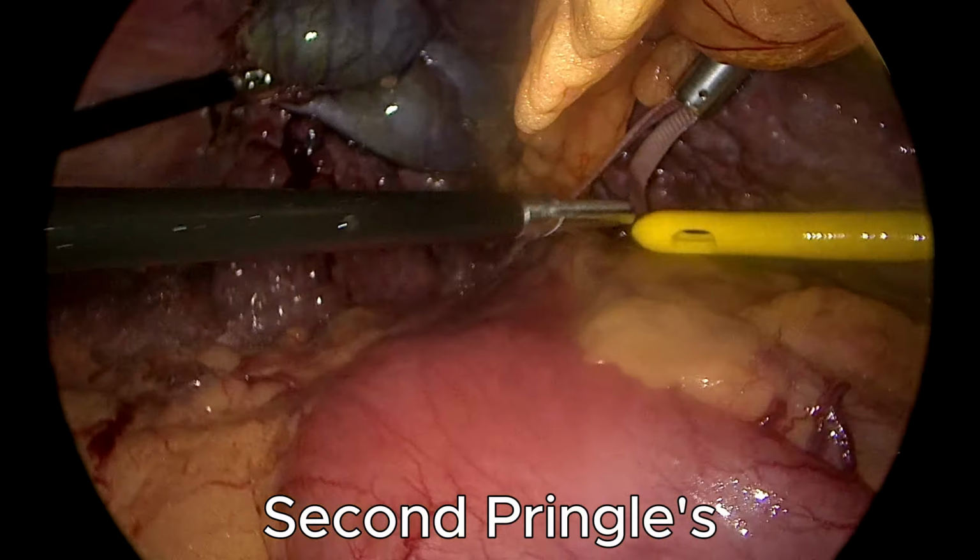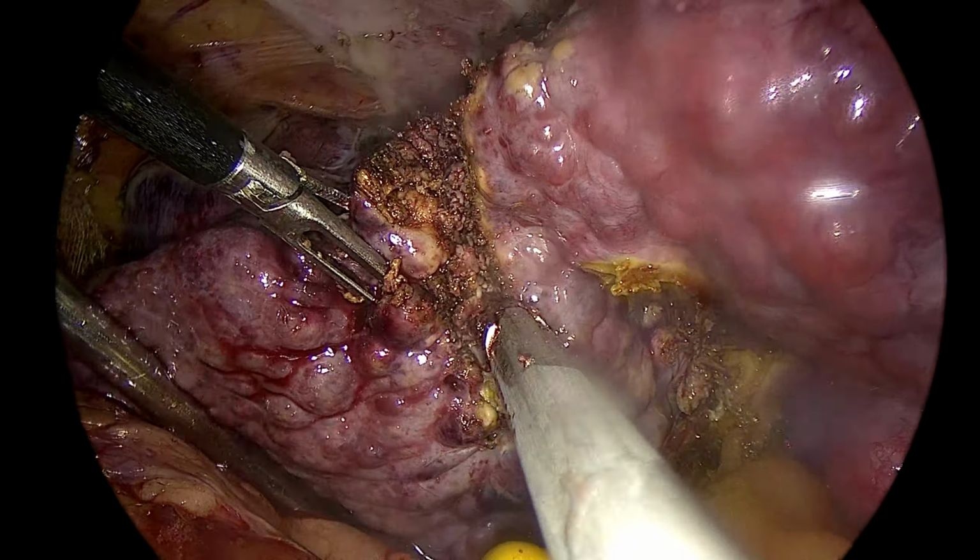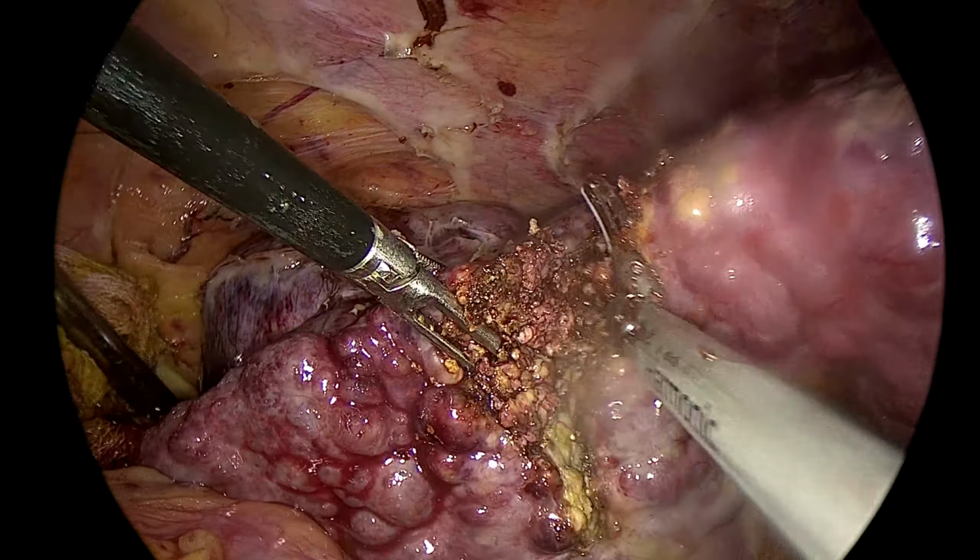Superficial dissection begins along the marked resection line using a ligature device. The cholecystectomy is completed by removing the gallbladder from its bed. The gallbladder is temporarily kept aside and will be removed at the end of the procedure along with the specimen. We now proceed with deeper parenchymal dissection using the harmonic scalpel. This device allows precise cutting and coagulation, minimizing blood loss, while progressing through the liver tissue toward the tumor.